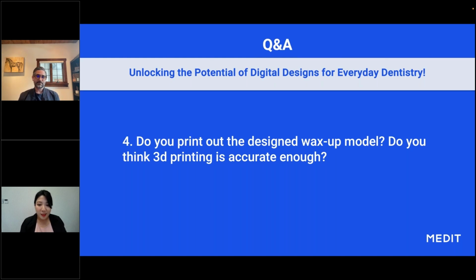Yeah, we get this kind of question from the users a lot, right? Yeah. I experimented with it, and I would take a backup impression and check these things, but you get to a point where you lose that sort of fear, because once you see it enough... And I do think when you start, you have to calibrate your staff, your printer, everything. So it's always good to ease into it.